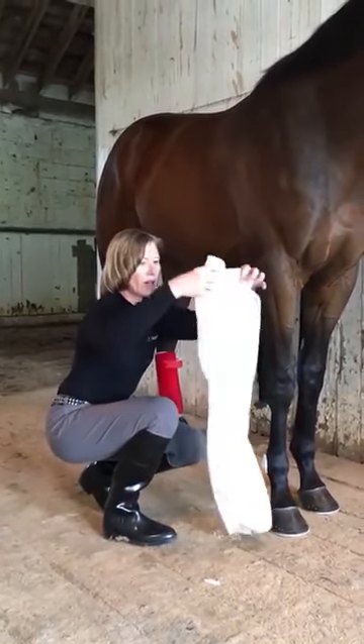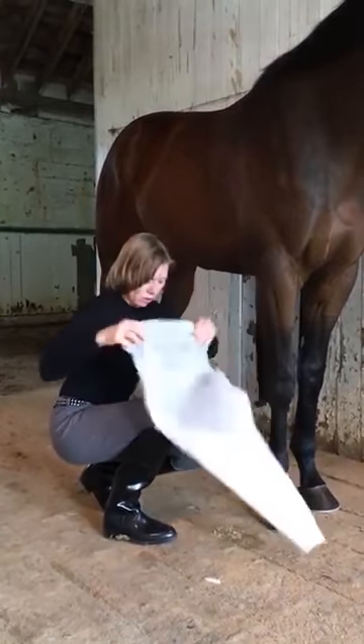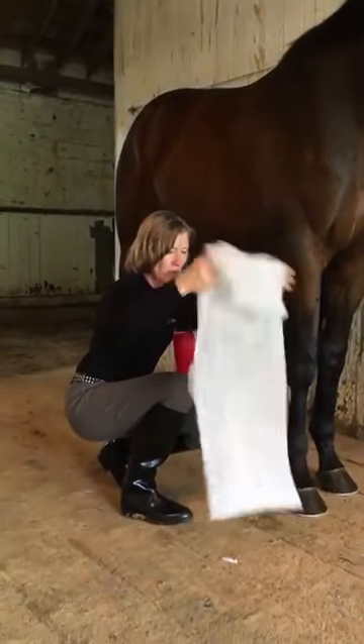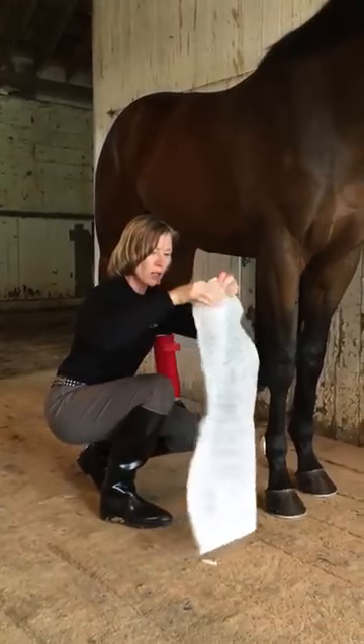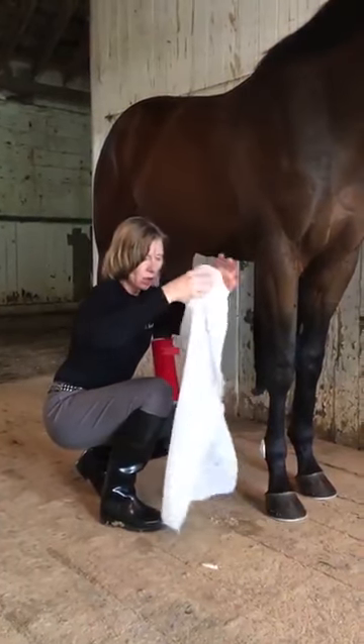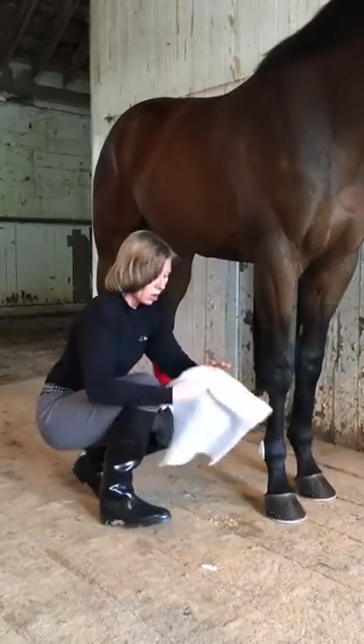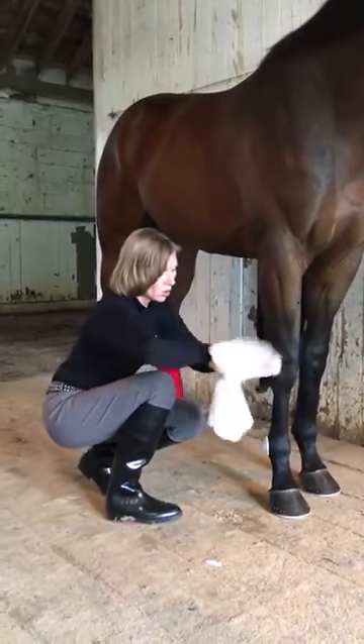You get this piece of cotton here. I just pulled apart this cotton from a large sheet, so one side is raw and the other side is smooth. You want to apply the smooth side to the horse's leg.